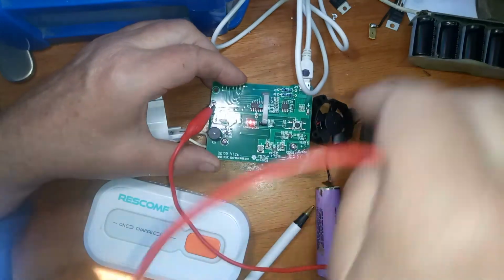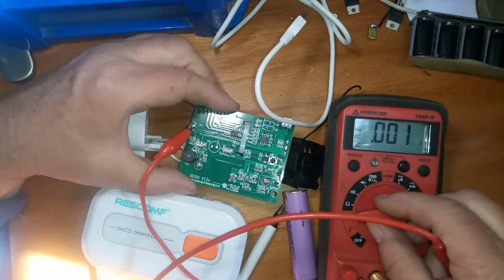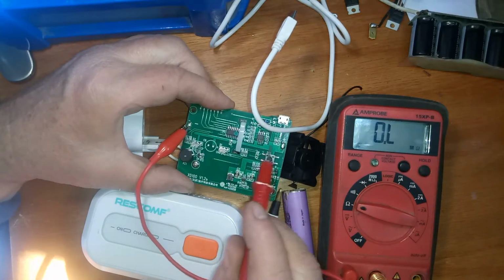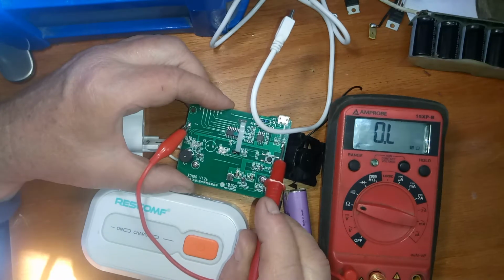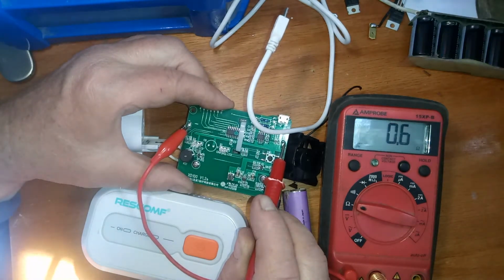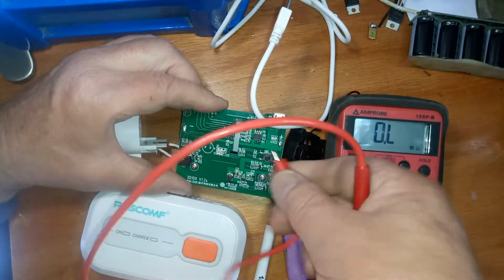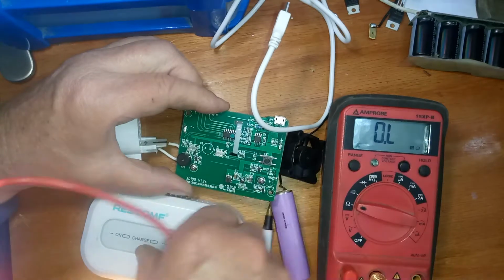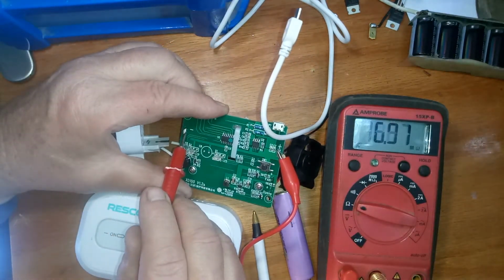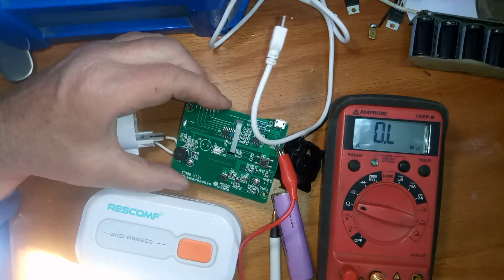And if we remove the charger, I guess you saw that. If you remove the charger, this is not something I recommend you do, but I've done this before. And it says 0.6 ohms that way. So the battery is a dead short.